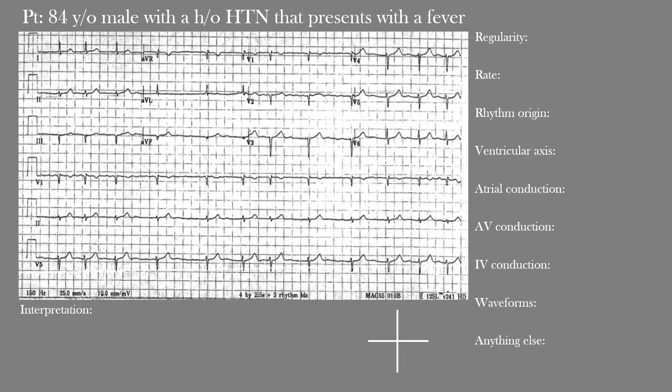Before we get started, let's review the approach we've been using to interpret EKGs. We have the patient's clinical presentation and the EKG below it. On the right side of the screen we have a list we'll go through before making our final interpretation. First, there is the regularity of the rhythm — are we dealing with a regular or irregular rhythm, and if irregular, is it regularly irregular or irregularly irregular? Next we have the heart rate.